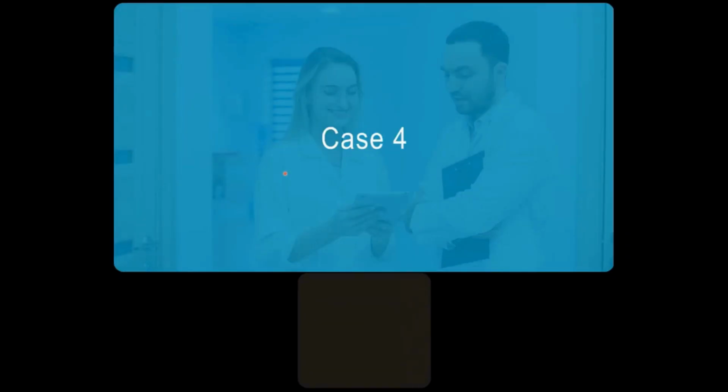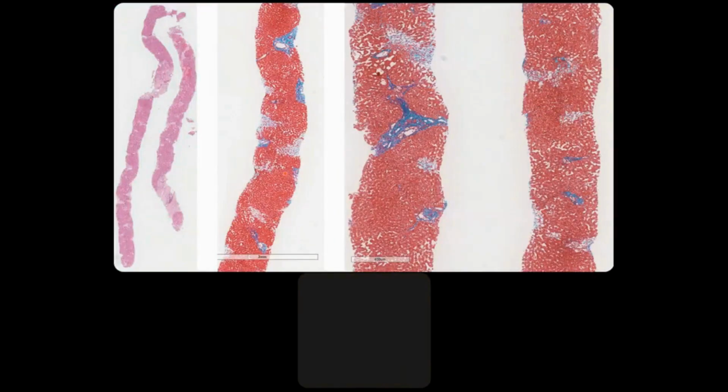So moving on to case 4, this was a middle-aged woman who presented with abdominal pain and ascites. Her liver biochemistry showed mainly a mixed pattern of liver enzyme elevation, but more cholestatic than hepatic. And the imaging revealed abnormal liver morphology, which raised the possibility of decompensated cirrhosis, which prompted this liver biopsy. So you can see that this liver biopsy is obviously abnormal.